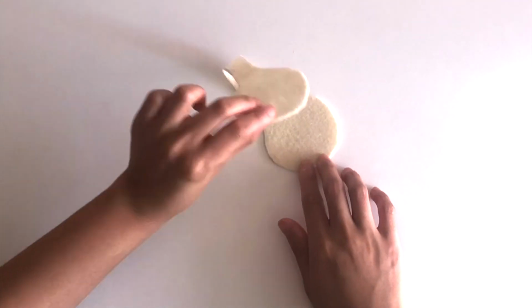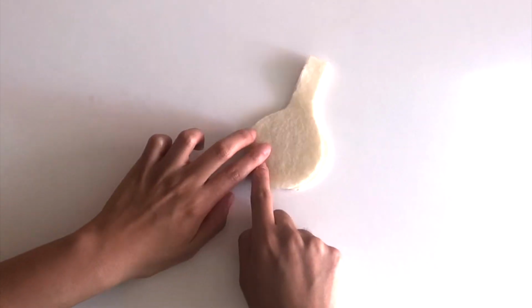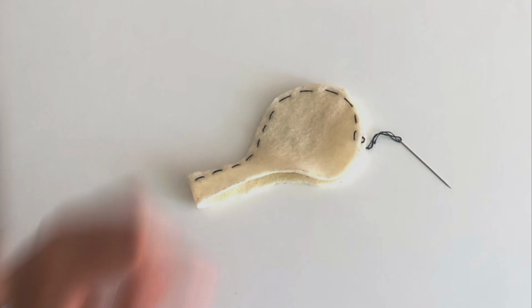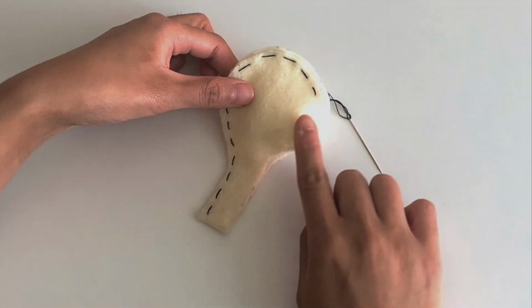Next, fold the ovary shape in half. You will do the same to the other ovary shape. You will sew along the edges, leaving some space for stuffing. Once you have placed some stuffing in, you can then finish sewing the edges closed.